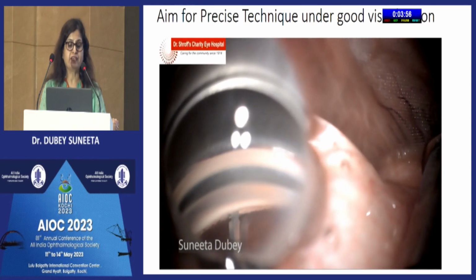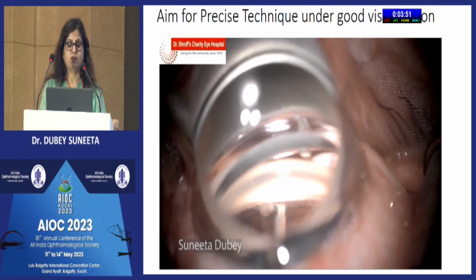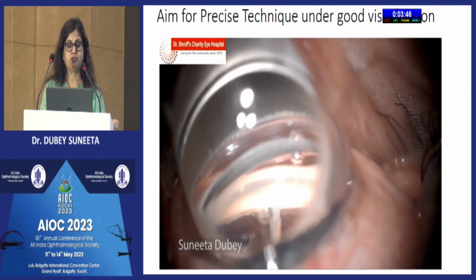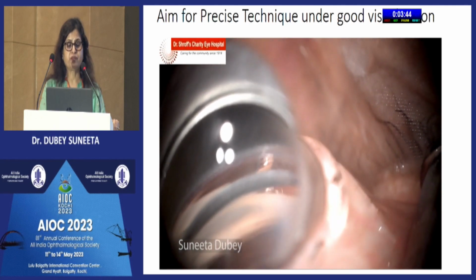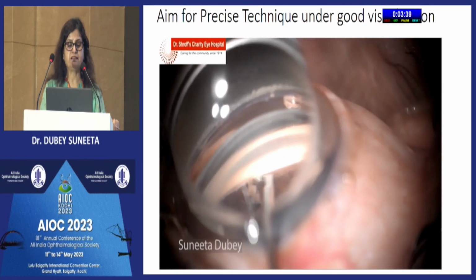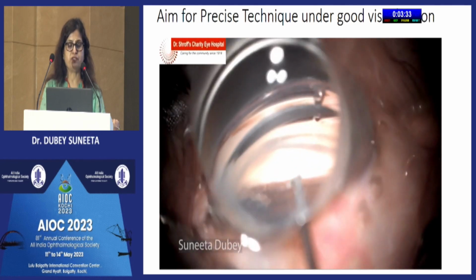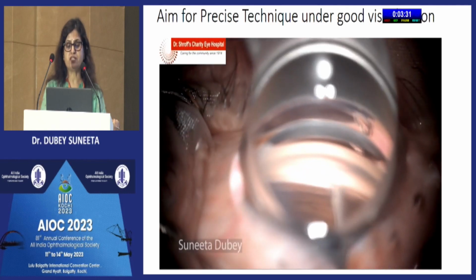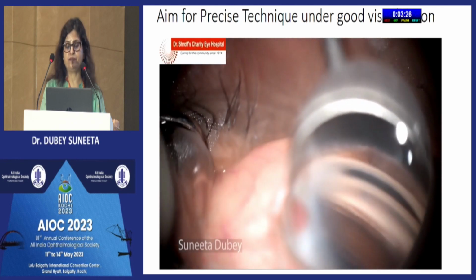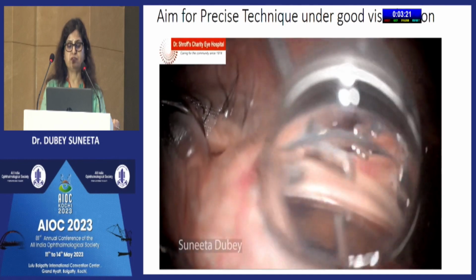As you engage the trabecular meshwork, you have to move along one side of the canal, as you can see, and you can nicely see this strip coming off. Be very careful that you are excising the right area. Once you have completed one side, just keep moving your gonioscope over the cornea, rotate your tip, and complete the procedure on the other side. You should see this trabecular strip come out during the procedure.